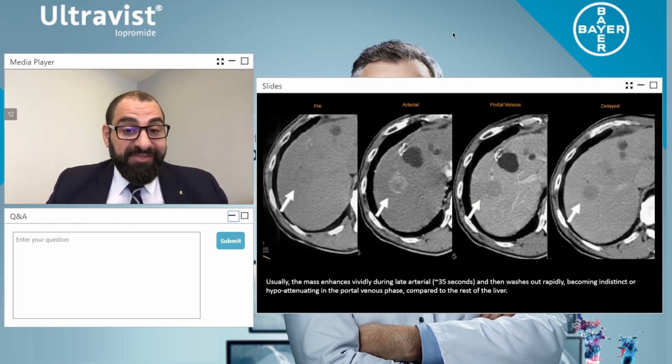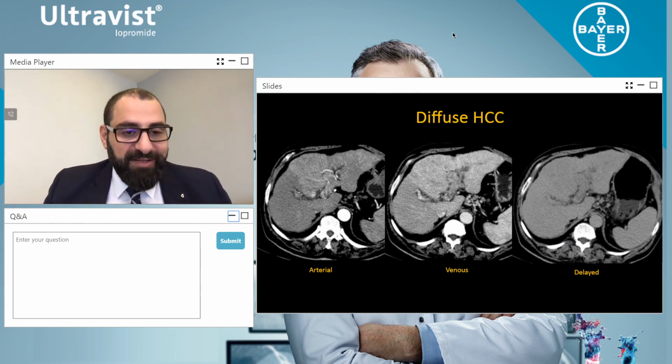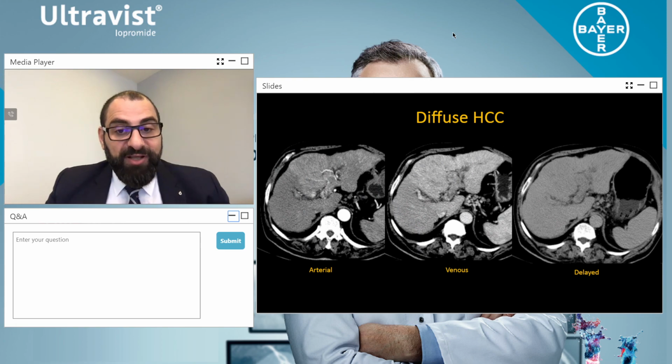With diffuse hepatocellular carcinoma, look at this in the arterial phase. Because this was an early arterial phase in the image to your left, we have perfusion deficit within the liver. When you look at the venous phase, look at the lobes of the liver between the left lobe and the middle of the right lobe, and in actual fact, you have tumor within the portal system. And then when we look at the delayed phase, it's completely filled in with contrast. This is a diffuse hepatocellular carcinoma.